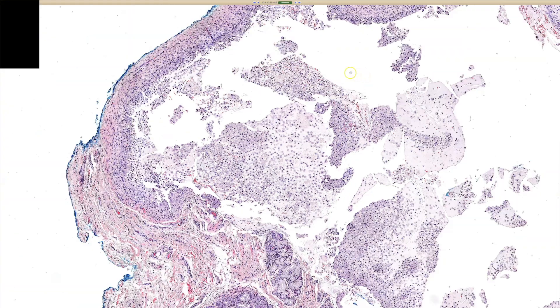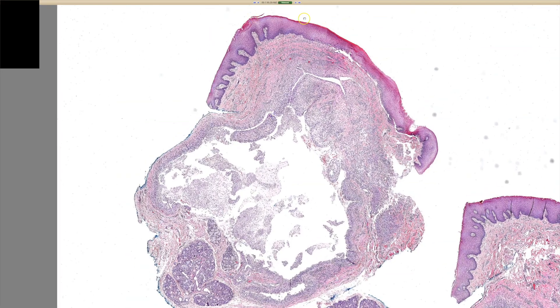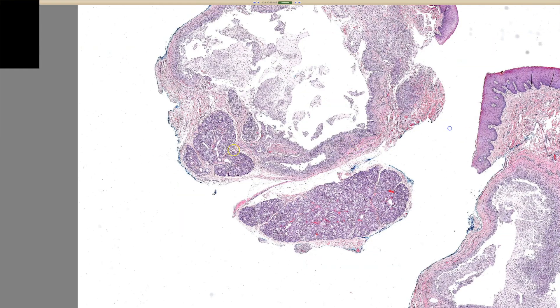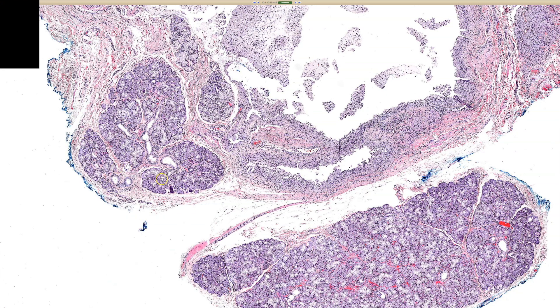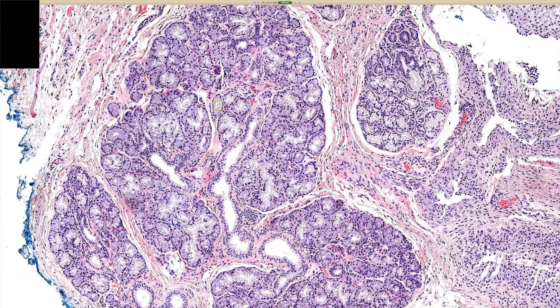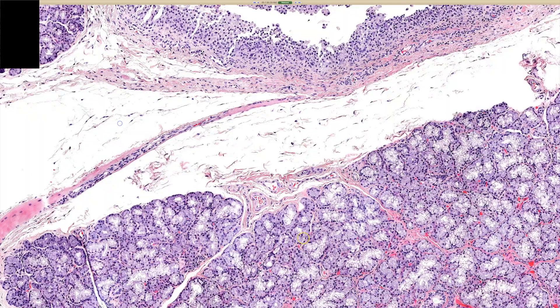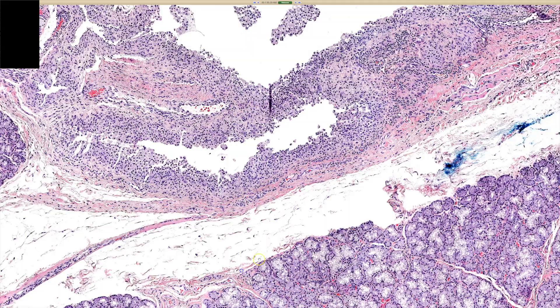This is about the best example you could hope for of a mucocele. The first thing is recognizing the site — we've got mucosa, because there's no granular layer, minimal keratin on top, and no skin adnexal structures. So this is from a squamous mucosa site. Down here we can see minor salivary glands, which are mucinous-type glands with ducts lined by a double layer of cuboidal or columnar epithelium — minor salivary glands on the mucosal surface of the lip and cheek.